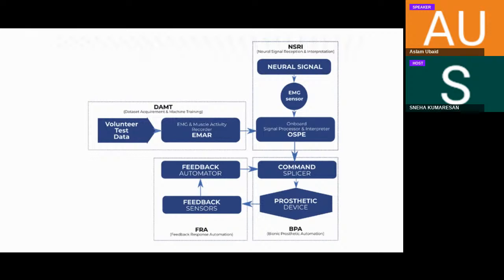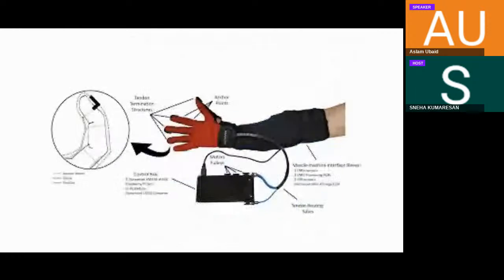So I guess the parts which were built were the device to harvest the EMG signals and muscle movements, as well as the 3D printed arm. And to an extent, they were really successful, but not to the extent which we would prefer. That is the whole story of ProBion. I hope you got a good idea about what it was and what it is right now.